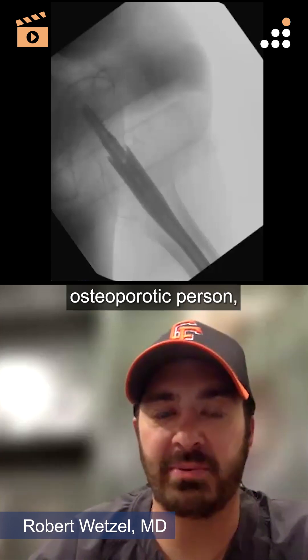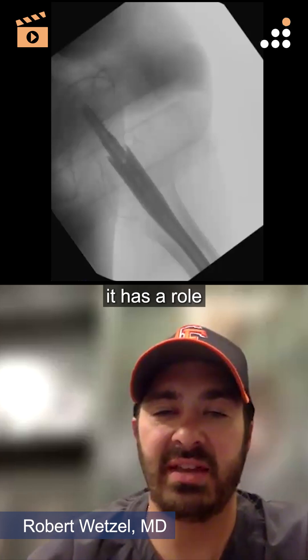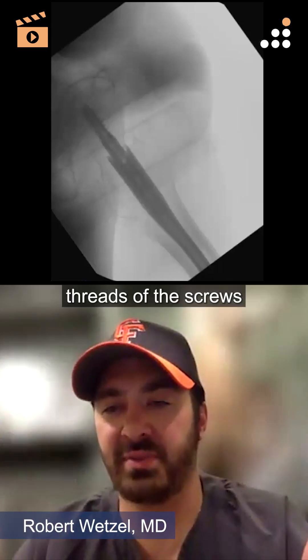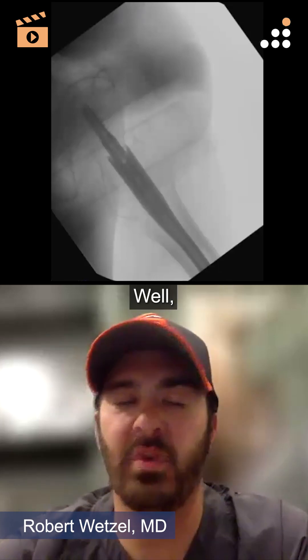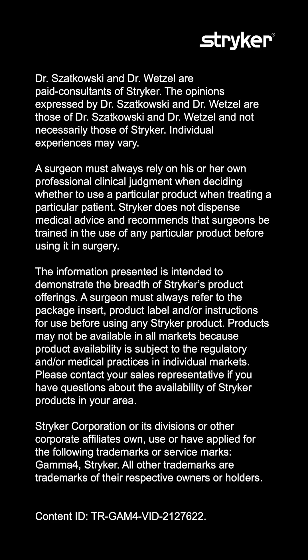Occasionally in a very osteoporotic person I would use an RC lag screw — it's not often, but I do think it has a role when you want to control rotation a little more, because it advances beyond the threads of the screws so you get more rotational control and a little more resistance to cut-out — or really, resistance to varus collapse.